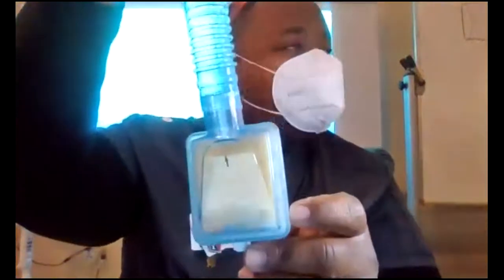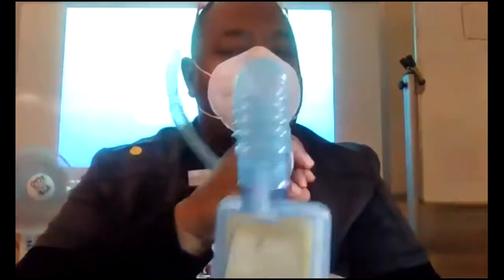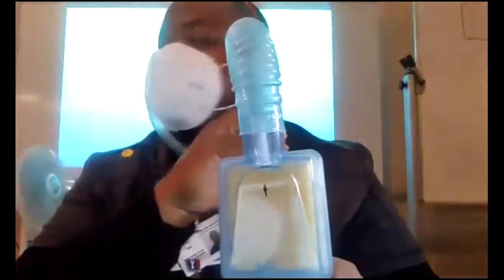Okay. This is the heat and moisture exchanger, called an HME. Remember I said that when I was doing those terminology? I said HME, and y'all were like, what is an HME? I said, it's a heat moisture exchanger. You'll learn about it later.